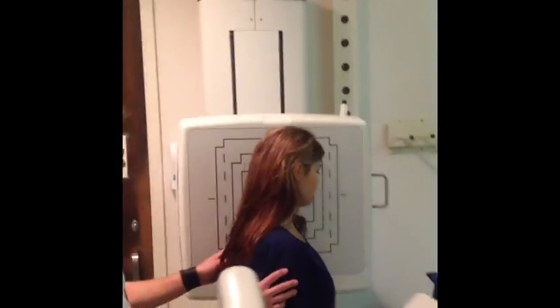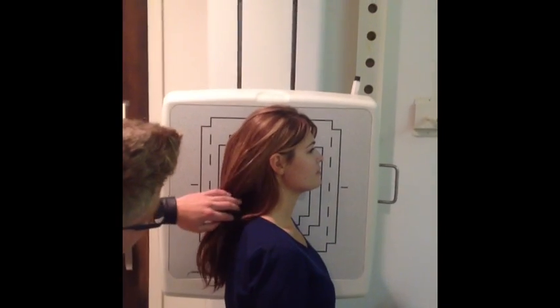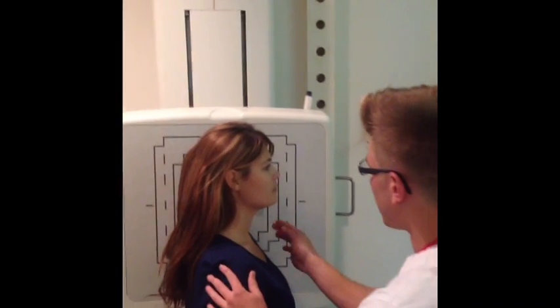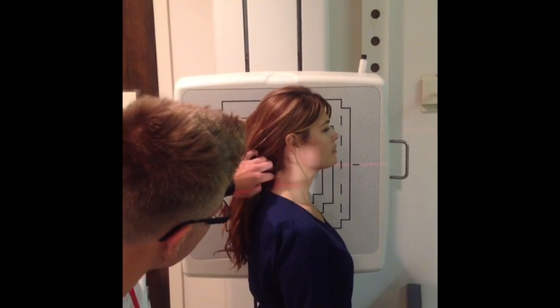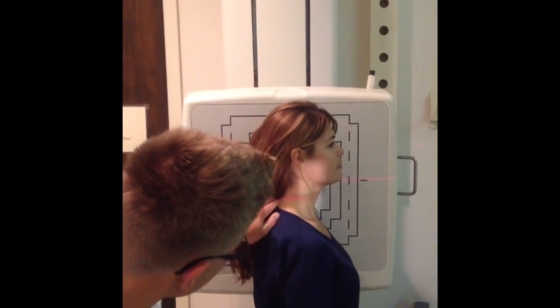I'm going to have you go ahead and put your left shoulder against the board there. I see you took your hair tie out — you don't have any earrings or a necklace? No. I'm going to center the mid-coronal plane at the level of C4.